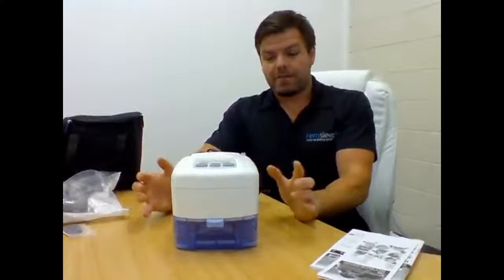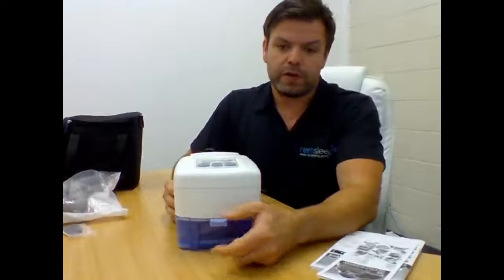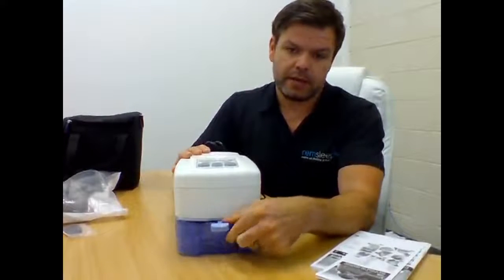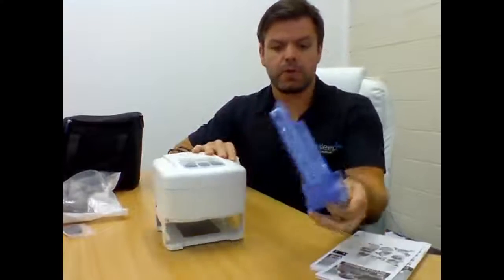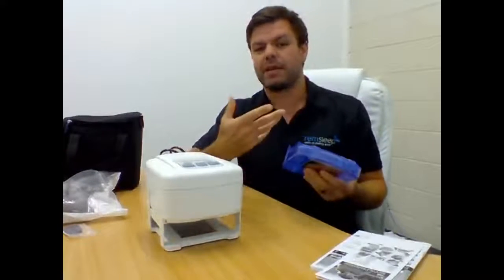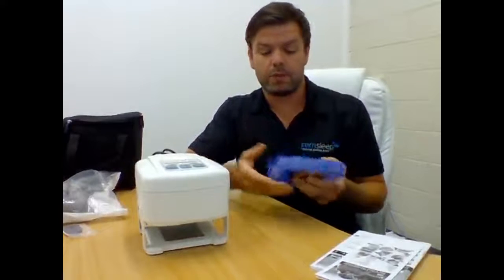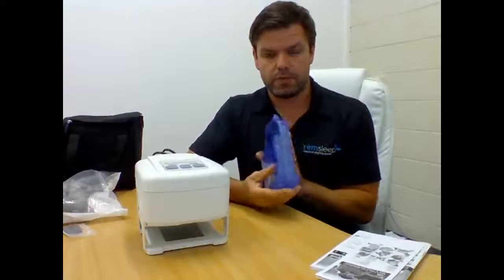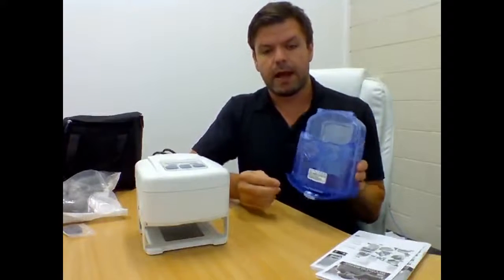Quick basic setup for it. All we got to do is fill the water chamber up at the base here. So we just pull this out. The chamber's a nice, big water chamber. It's got a nice wide heater plate on the bottom, which means that you get humidification nice and quickly. It heats up the water really quickly, so you get nice humidification straight away. So humidification is really good.